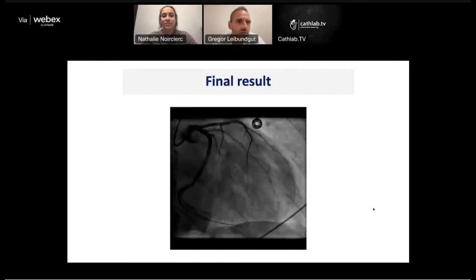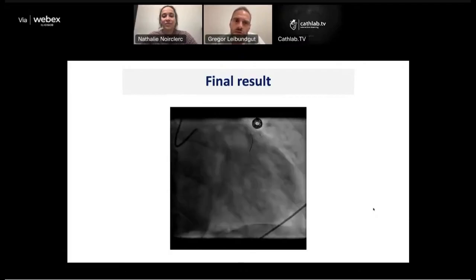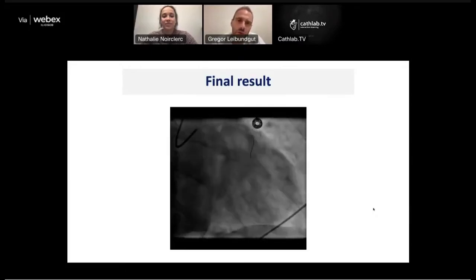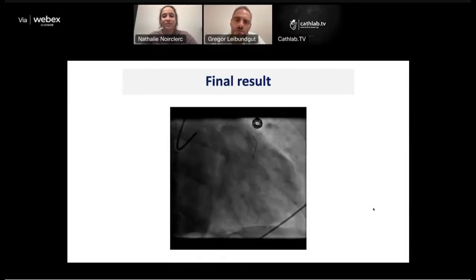And the other one is in old stents, and there we see that old stents also work less. And if you have dual or triple layer stent, it works even less. So supporting the idea that the cage absorbs a lot of the acoustic energy of the shockwave balloon.